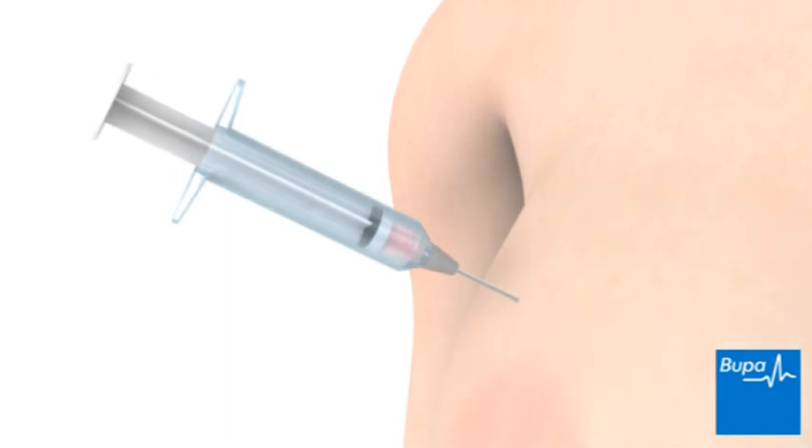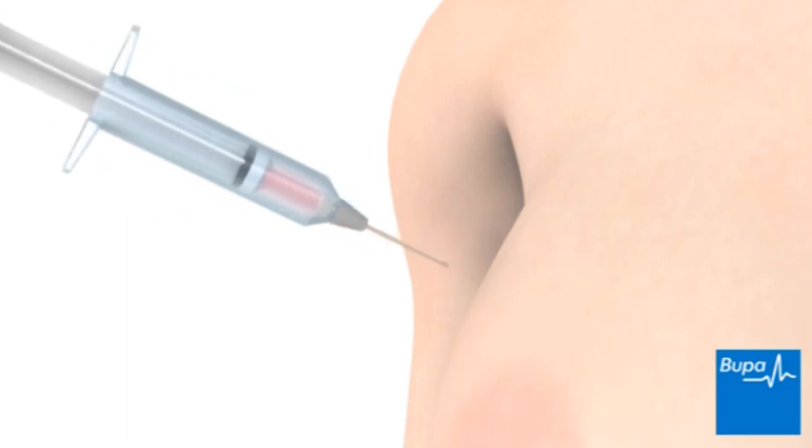Breast tissue is drawn out into the syringe. The procedure is quick and a local anaesthetic isn't usually needed. After the samples are taken, the needle is carefully removed and the injection area is covered with a plaster.